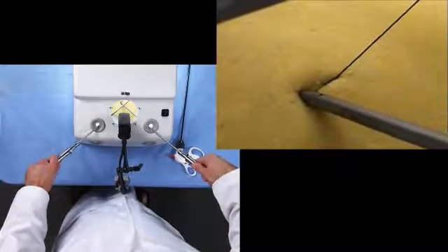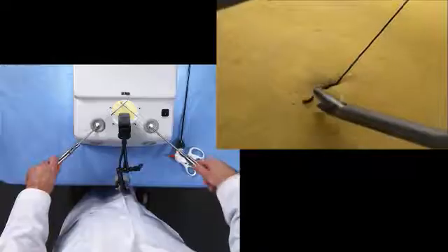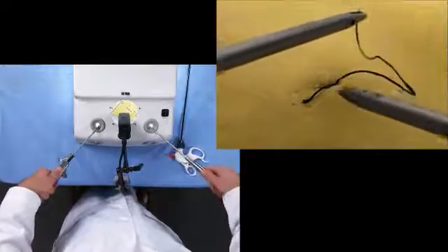We take all of the tension out with the left hand. We then can release the tag, come back over the knot.